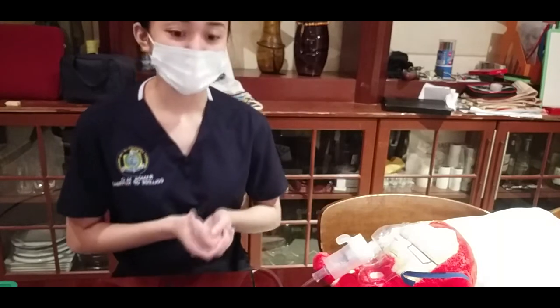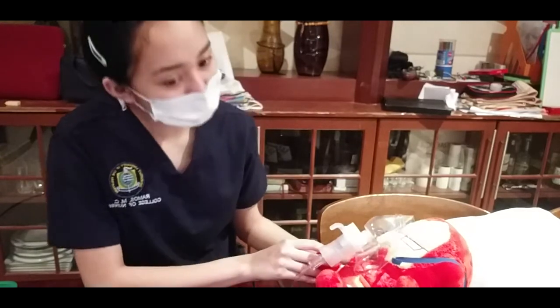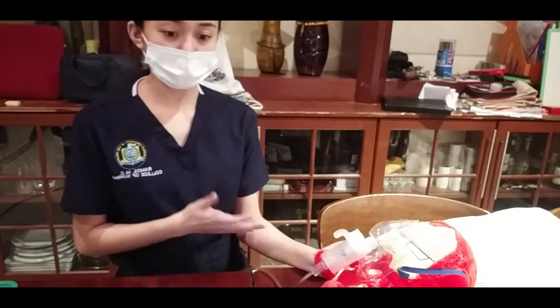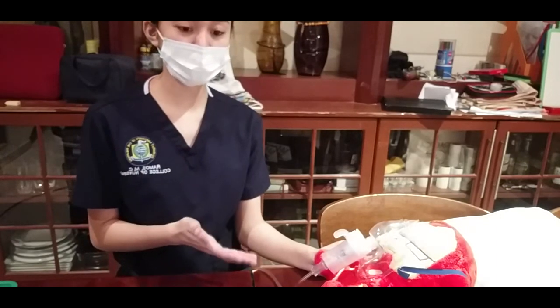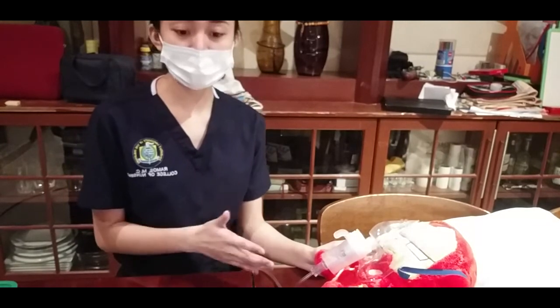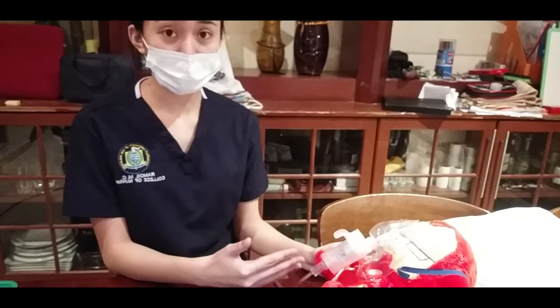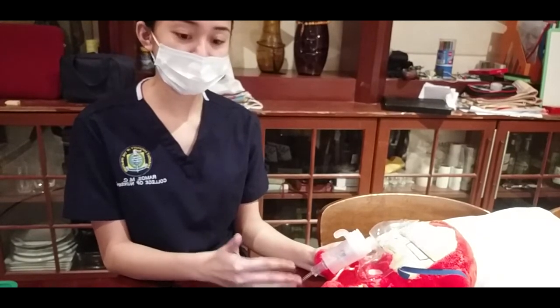Next, I will be observing the external ears of the patient, the bridge of the nose, the nares and nasal mucous membranes for evidence of skin breakdown. Oxygen therapy sometimes causes dryness of nasal mucosa, and the delivery device can cause skin breakdown where the device comes in contact with the face, neck, and ears. And I will be staying with the patient until it is safe to leave to confirm that the patient is already safe and has stable vital signs.